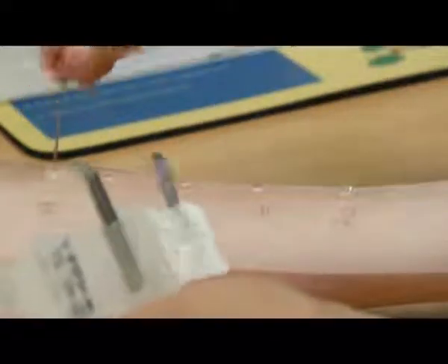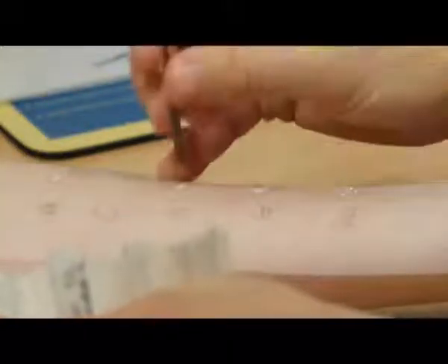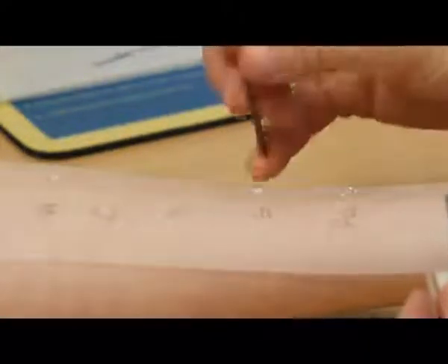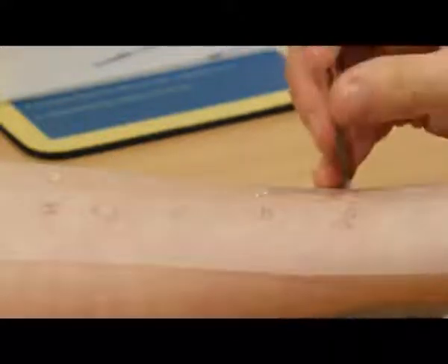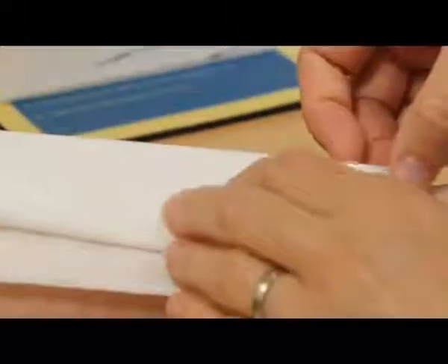And obviously we use a different one of these for each solution so that you don't have a cross-reaction and not know what you actually were allergic to. So if we use the same one all the way down, you just wouldn't actually know. I'm just going to blot that side for you.